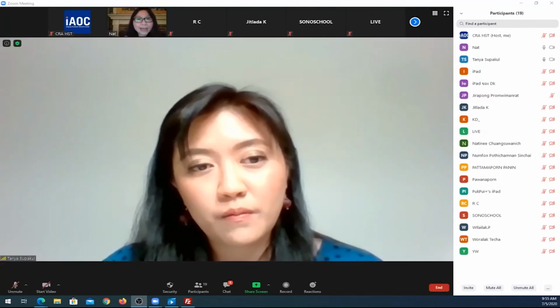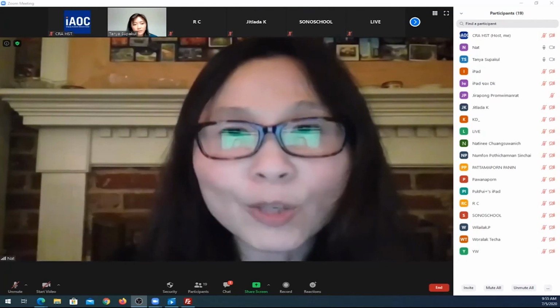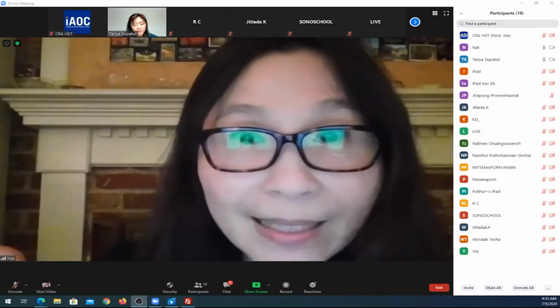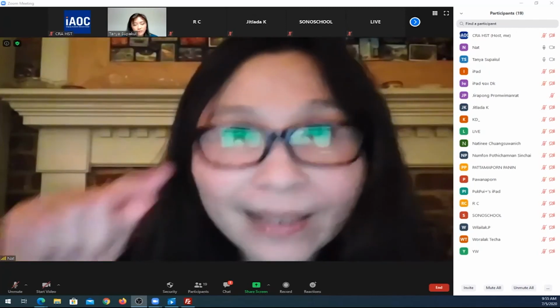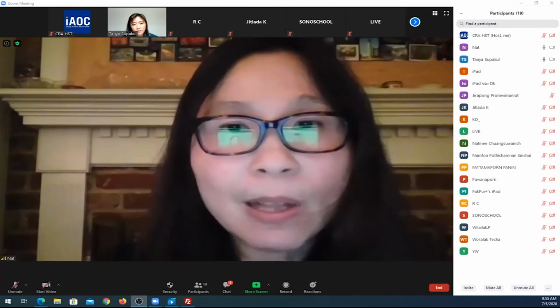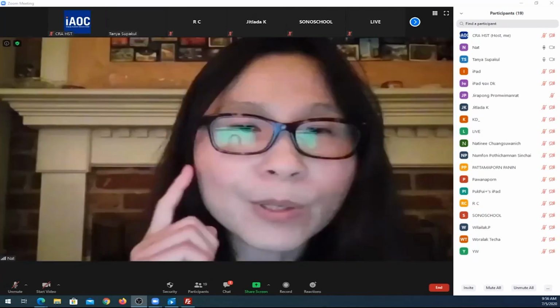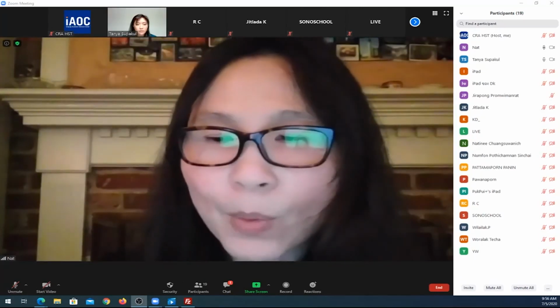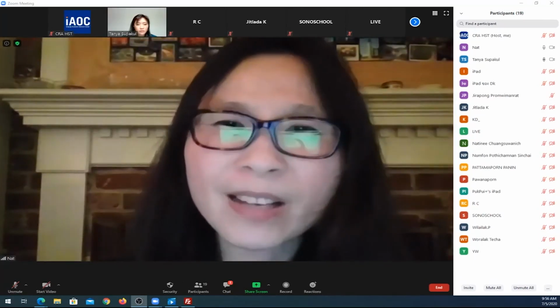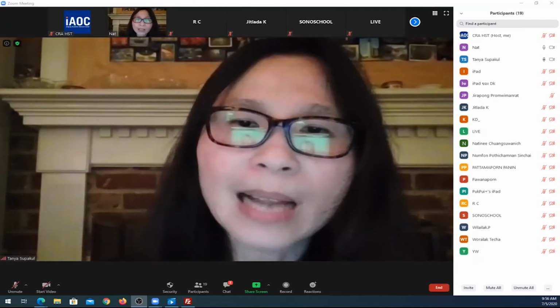Sometimes we look at the images and have to disable the automatic scan and look by eye, because sometimes the cardiac output is so slow that if you scan, you won't get good enhancement in the coronary artery. So we have to use our eyes, disable the mode, and it really depends on the experience of the technologist. Luckily, we have a good one here.